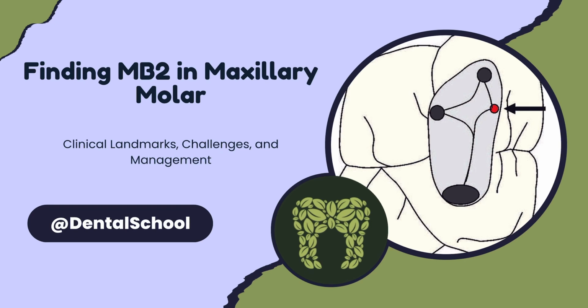Today, we're going to dive into a really important topic in endodontics, the consequences of an untreated MB2 canal, as well as how to locate, diagnose, and treat it effectively. It's one of those topics that can really make or break the success of root canal therapy. So let's walk through everything you need to know.